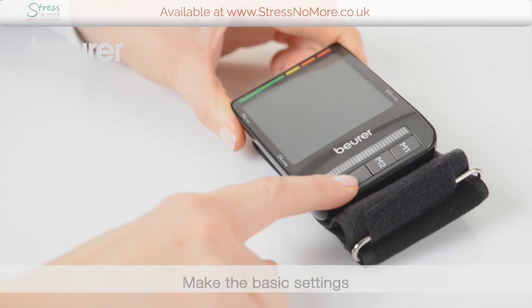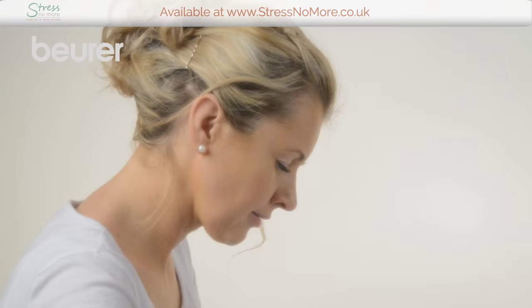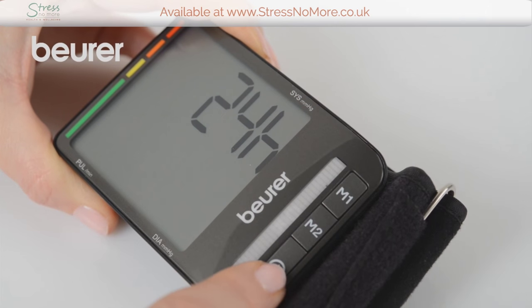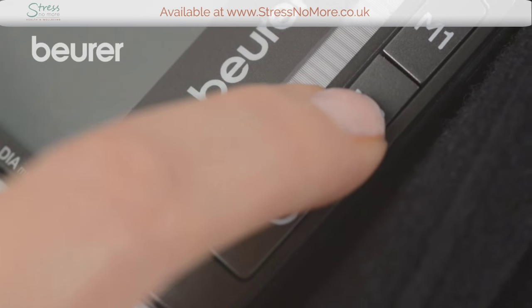Set the date and time format. Press and hold the start-stop button for 5 seconds. The hour format will start to flash. Set the desired hour format using M1 or M2. Press start-stop to confirm your selection. Set the date and time in the same way.